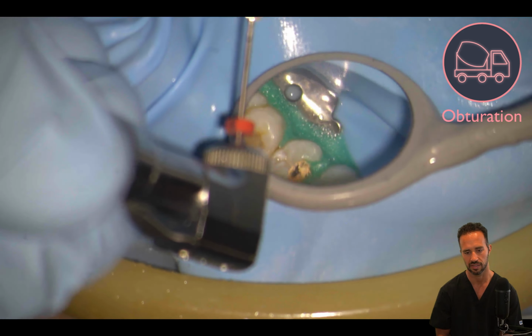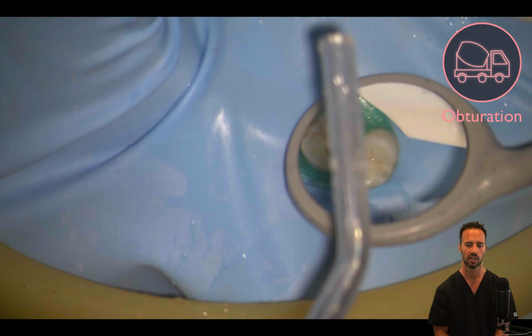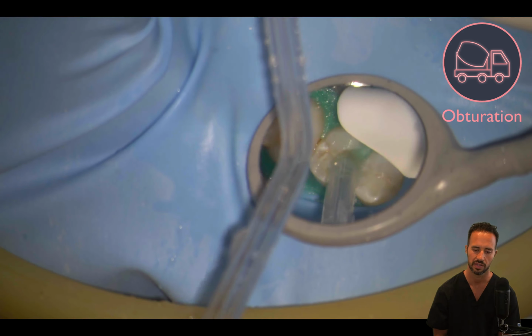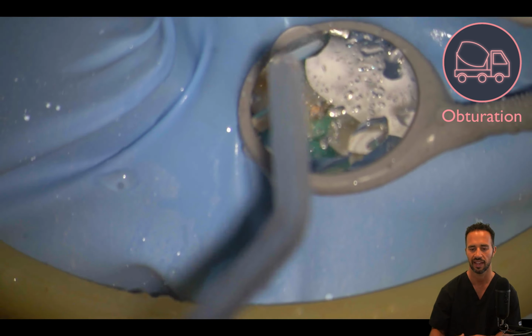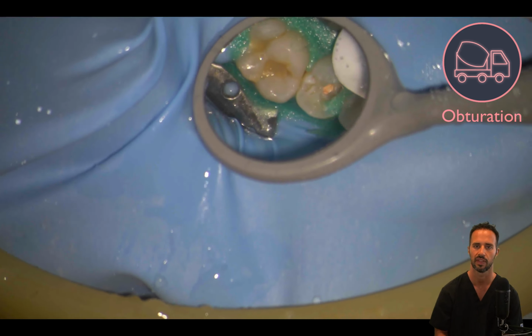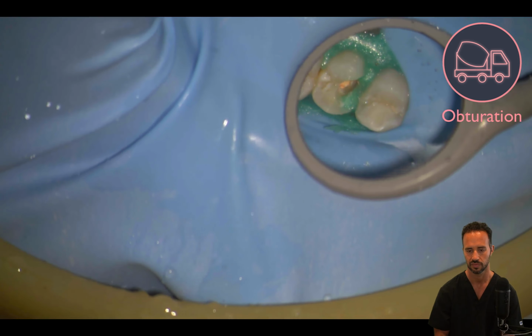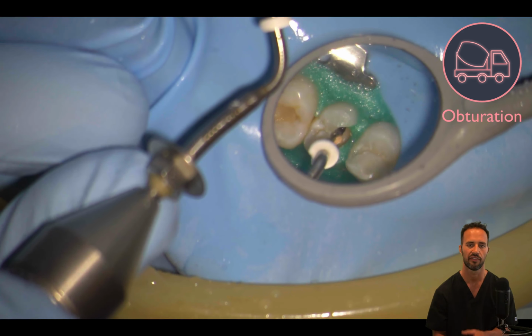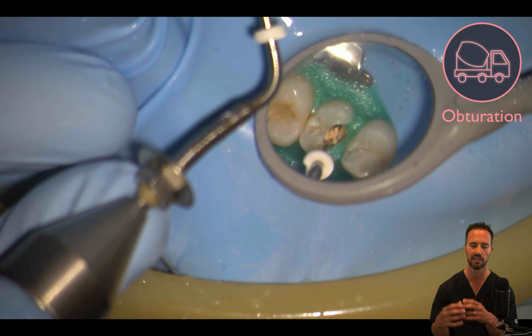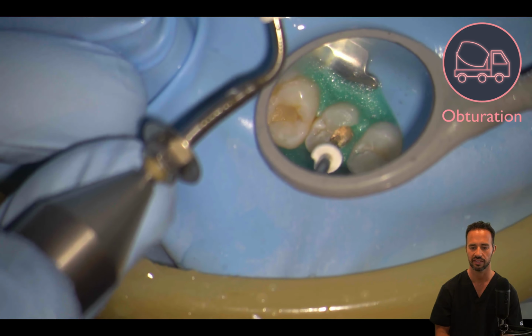And you'll have a lot of excess gutta percha, obviously, from your post space preparation that you'll need to manage, but it's not too hard, especially in a multi-canal case, because you have room to work at the level of the canal orifice. All right, so you can see that's kind of taking shape, and I'm just kind of making my fine-tuning and final adjustments to deliver a nice, clean end product to my referring dentist.